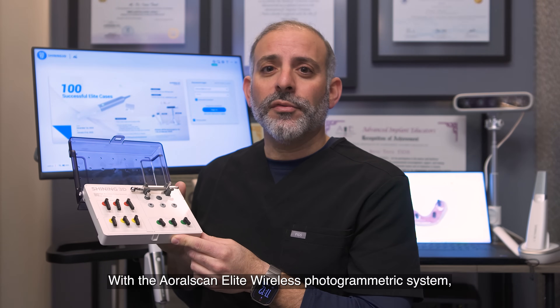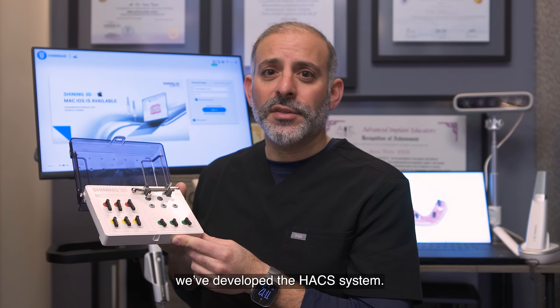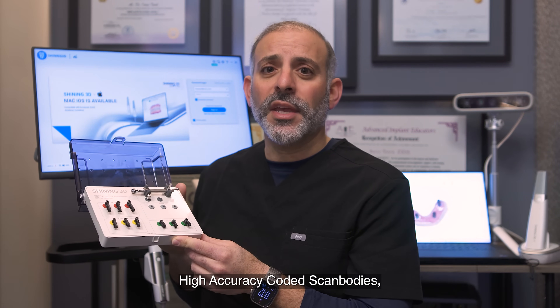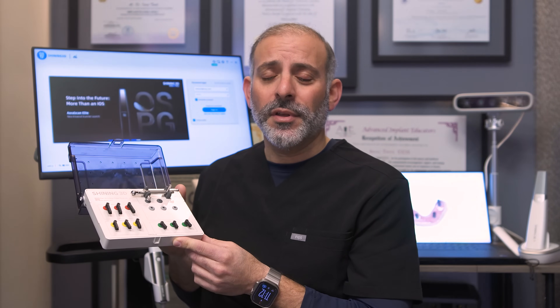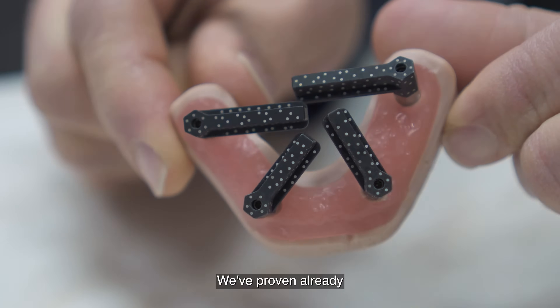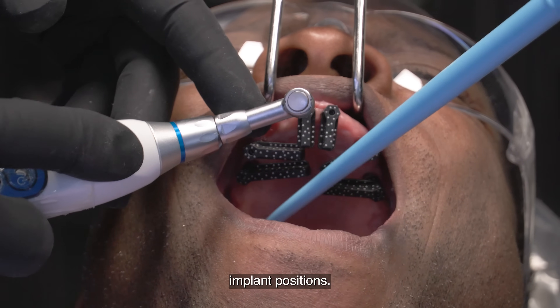With the Elite intraoral photogrammetric system, we've developed the HACS system — High Accuracy Coded Scan bodies — to be used for intraoral photogrammetric implant capture. We've proven already that this is one of the most accurate ways to capture implant positions.